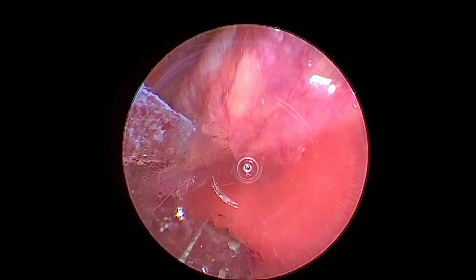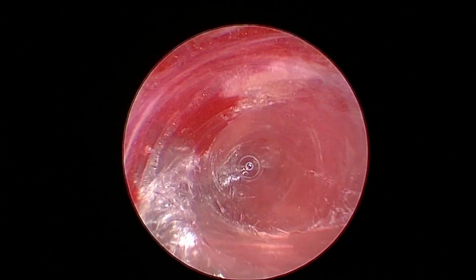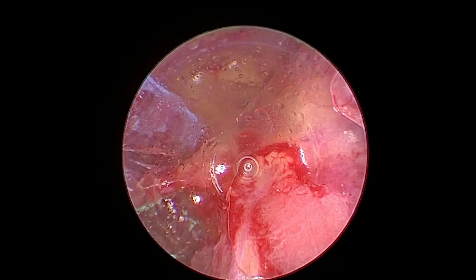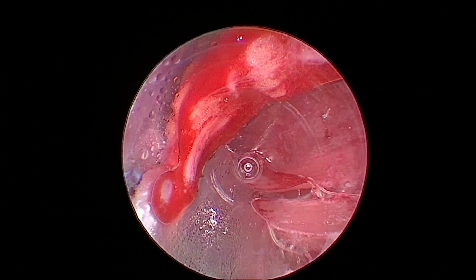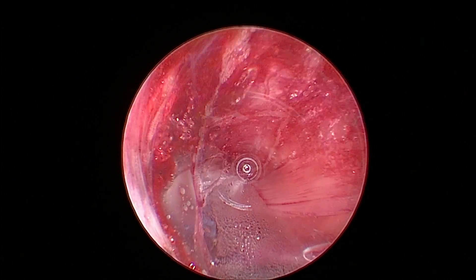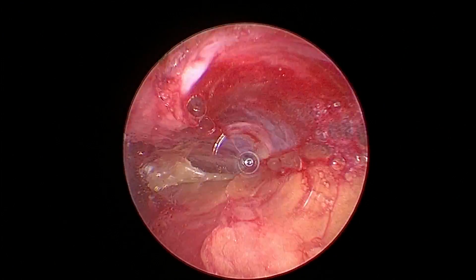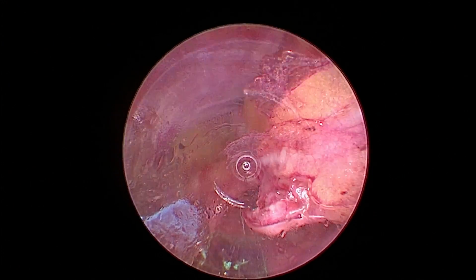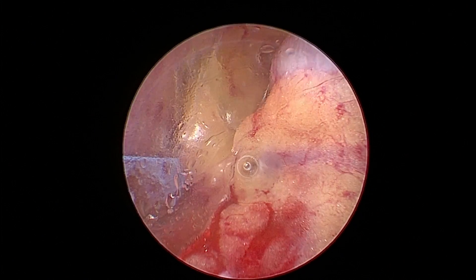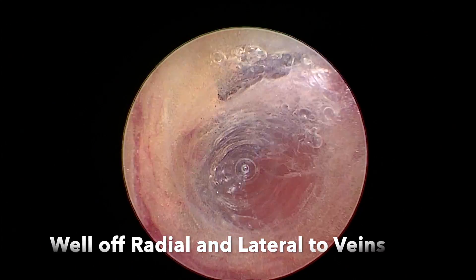There are a lot of advantages with the Venapex — it's a soft trocar that you're putting on the radial artery at the wrist. The bipolar cautery with high-density energy that's only going between those two fine blades is reducing thermal spread and any charring. It delivers high energy, so it's going to create a nice seal so your tunnel without a tourniquet stays dry. You can see I've got a nice pedicle with both paired veins intact, some adventitia, some adipose tissue — I'm well off the artery and lateral to the veins.